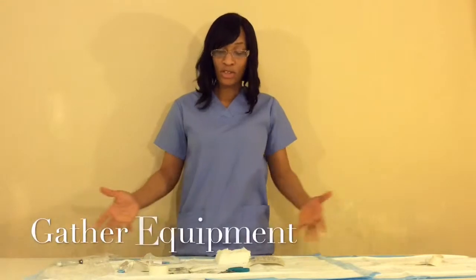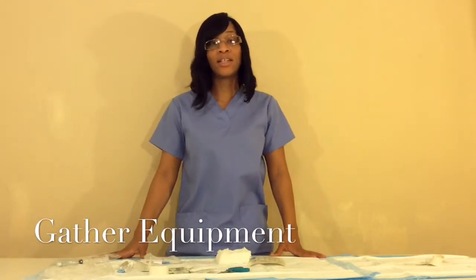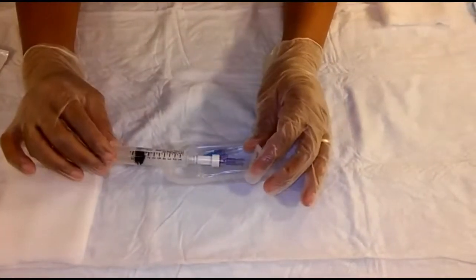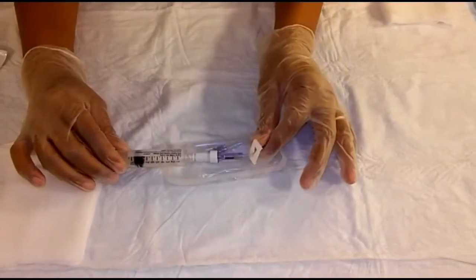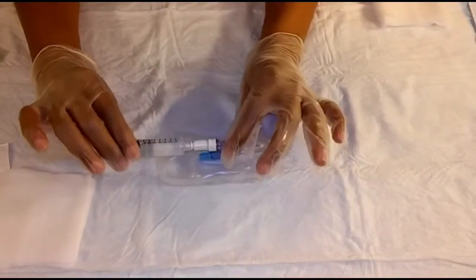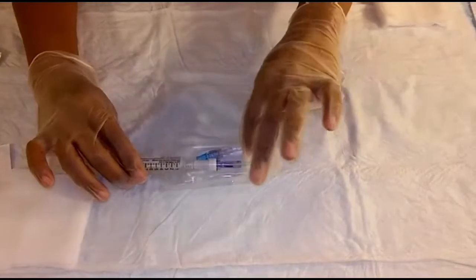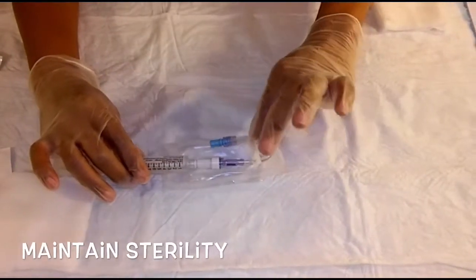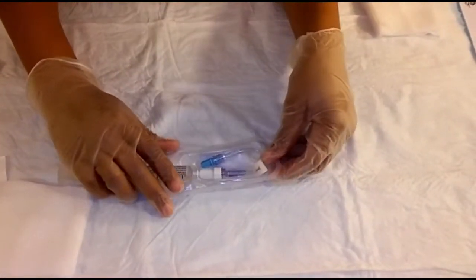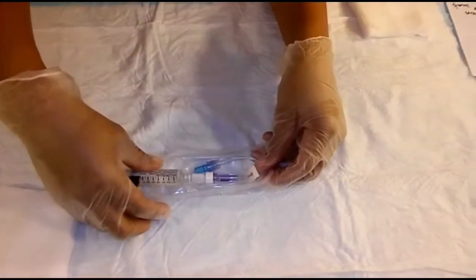After that, you want to gather all your materials and then perform hand hygiene. You're going to need clean gloves, and here I have my extension set and also my saline flush. I've connected them and I'm keeping the distal portion sterile, setting it aside until after I've completed my venipuncture.